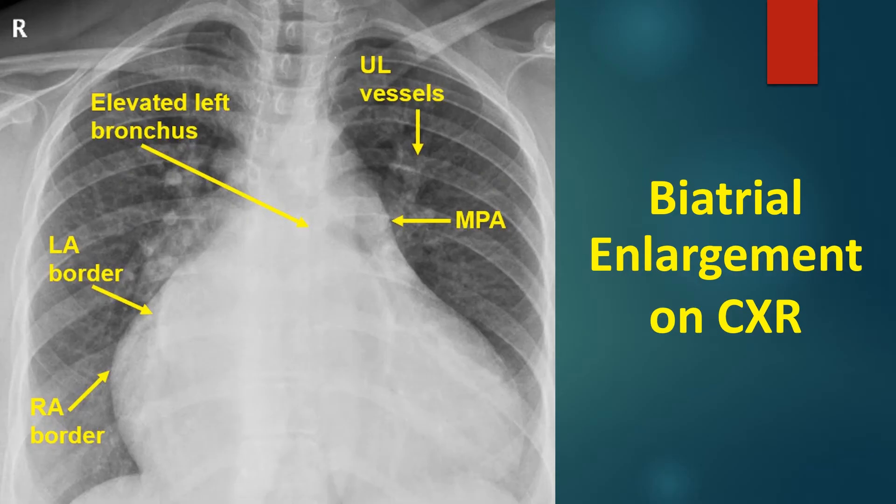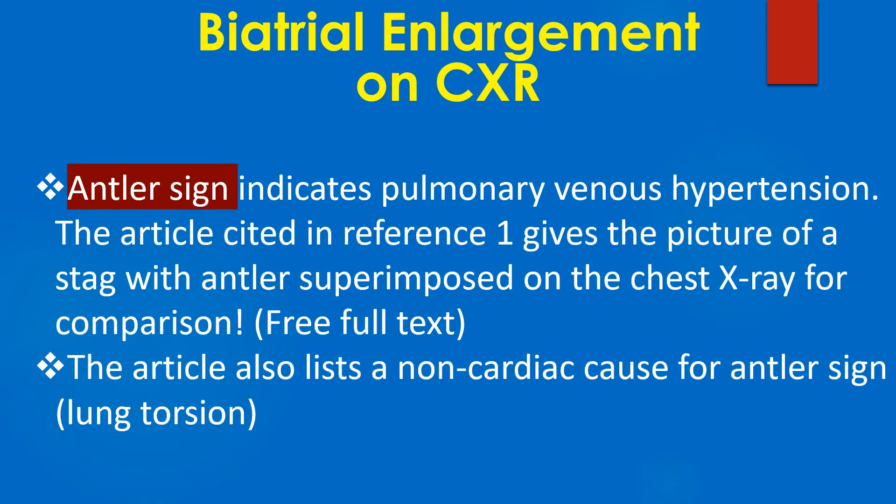The main pulmonary artery shadow is on the left upper cardiac border. The right hilum is prominent due to enlargement of the right pulmonary artery. Upper lobe vessels are prominent, known as the inverted moustache sign, stag's antler sign, and cephalization. The antler sign indicates pulmonary venous hypertension.